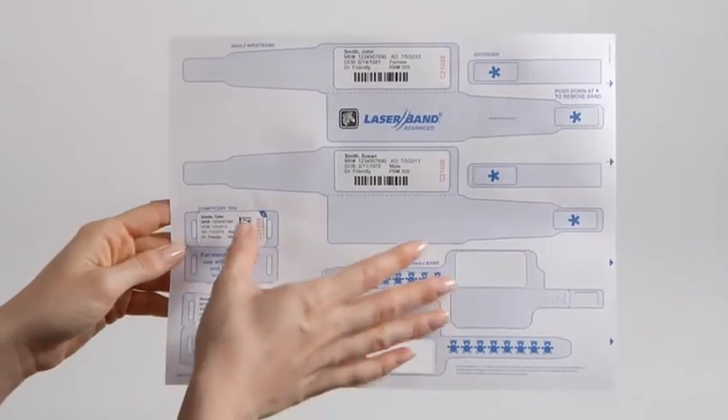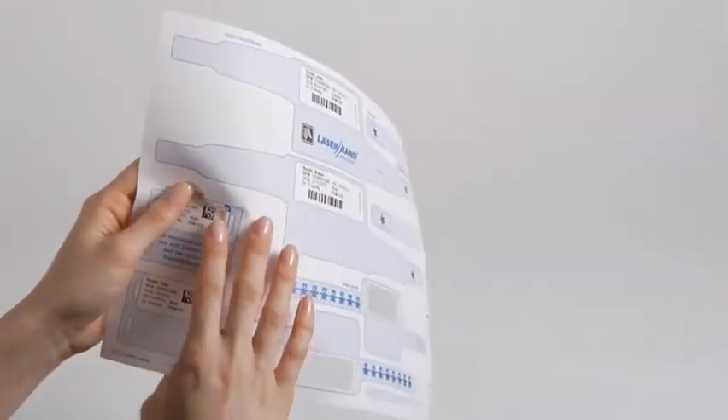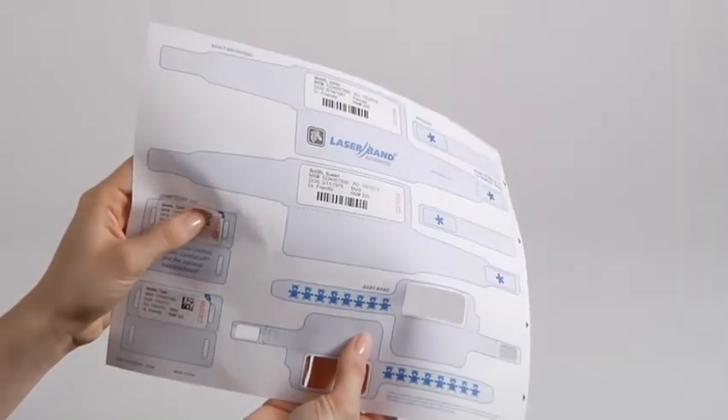To assemble the infant ID tag, hold the printed sheet firmly, then press the blue asterisk and push it through the sheet. Be sure to only press on this spot and not the shaded area, which is where the ID tag is attached to the carrier sheet.